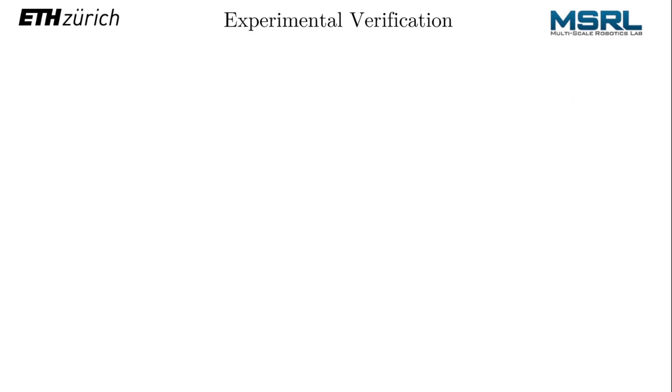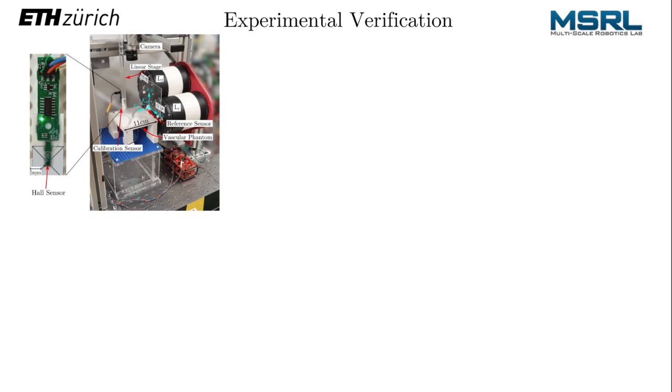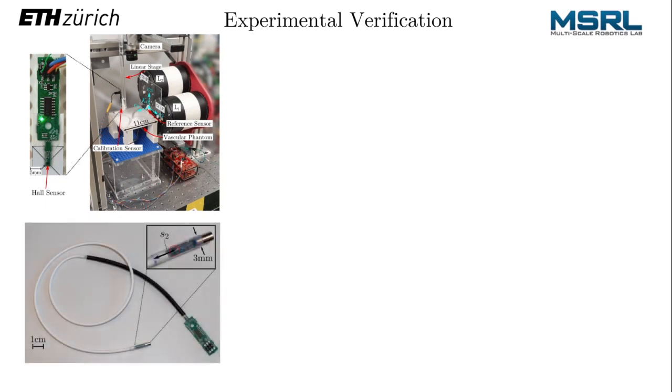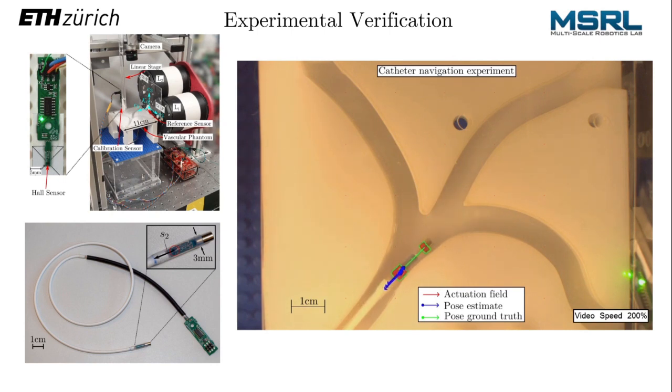To evaluate the proposed localization technique, the phasor matrix was measured in the workspace of an actuation system consisting of 3 electromagnets using a linear positioning stage with an attached field sensor. After this calibration procedure, the localization was tested using a catheter prototype with an embedded sensor and distal magnet. The catheter was placed in a 2D phantom for navigation purposes. The position of the catheter was recorded using an overhead camera which provided the ground truth for the catheter position. The catheter could be advanced or retracted using an advancement mechanism.